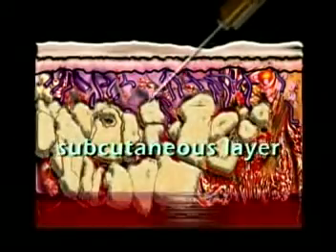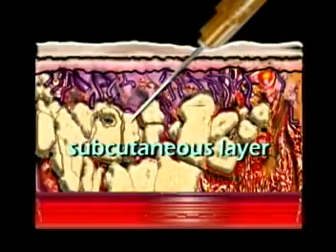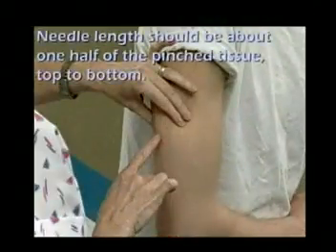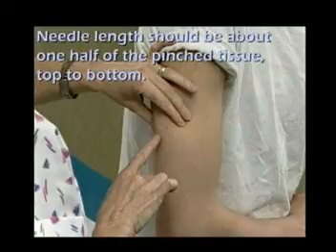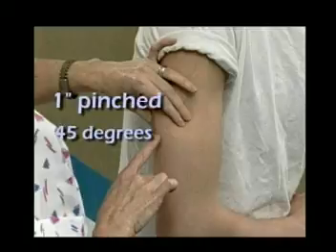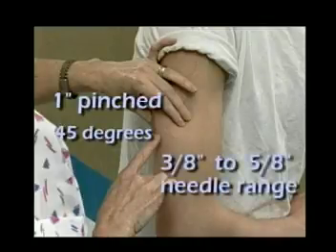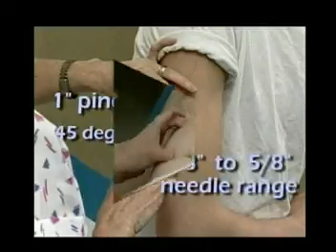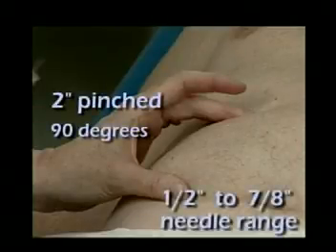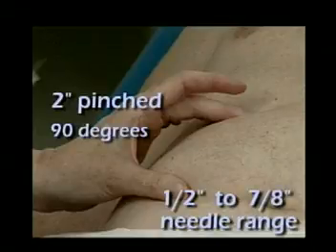The amount of subcutaneous tissue present is important for determining both needle length and angle of injection. Needle length should be about 1/2 of the pinched tissue top to bottom. If 1 inch is pinched, use a needle in the range of 3/8 to 5/8 inch at 45 degrees. If 2 inches are pinched, use a needle in the range of 1/2 to 7/8 inch at 90 degrees. A needle longer than 7/8 inch should never be used.